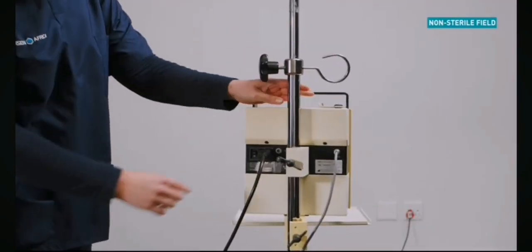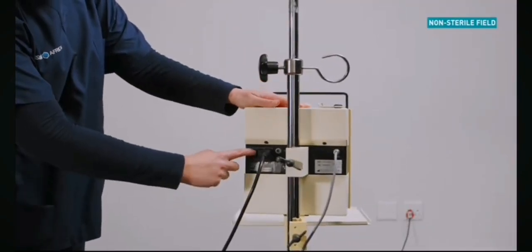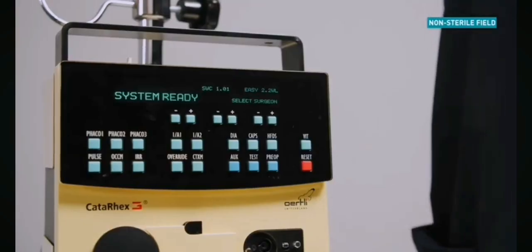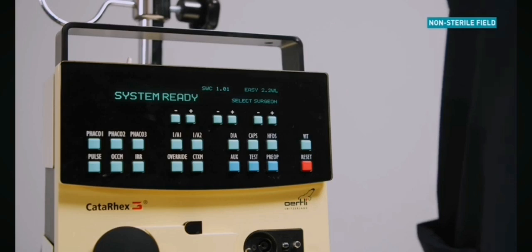Select the on-off switch situated at the back of the machine to power on. If the startup function has been completed successfully, the system-ready message will be displayed.